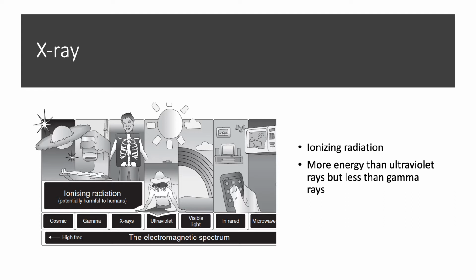This process of producing X-rays is extremely inefficient, so most of the energy in the beam of electrons is wasted as heat. This is why X-ray tubes need to have advanced cooling mechanisms. The X-rays produced then pass through the patient onto a detector mechanism which produces an image.